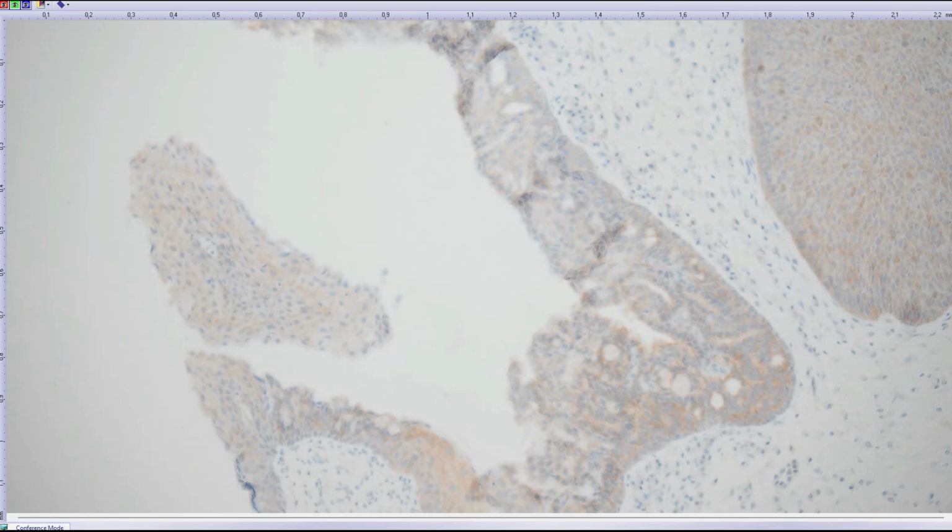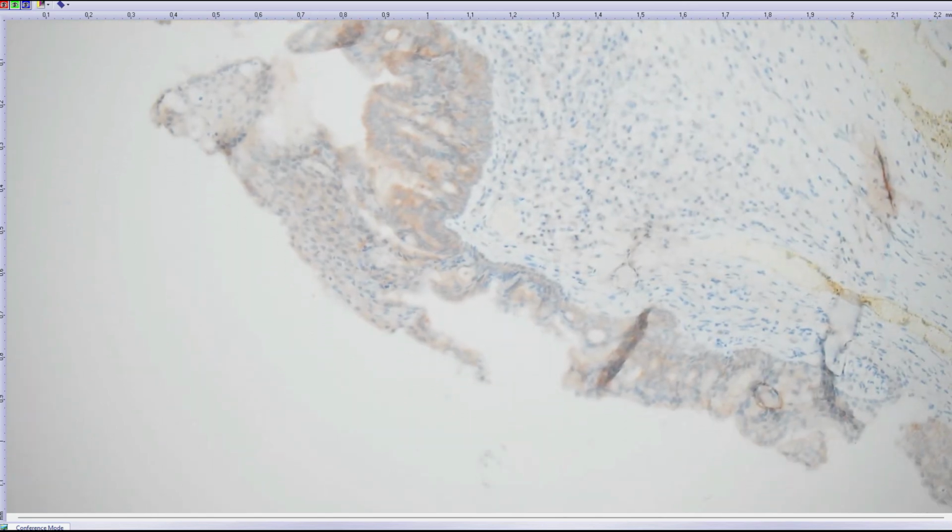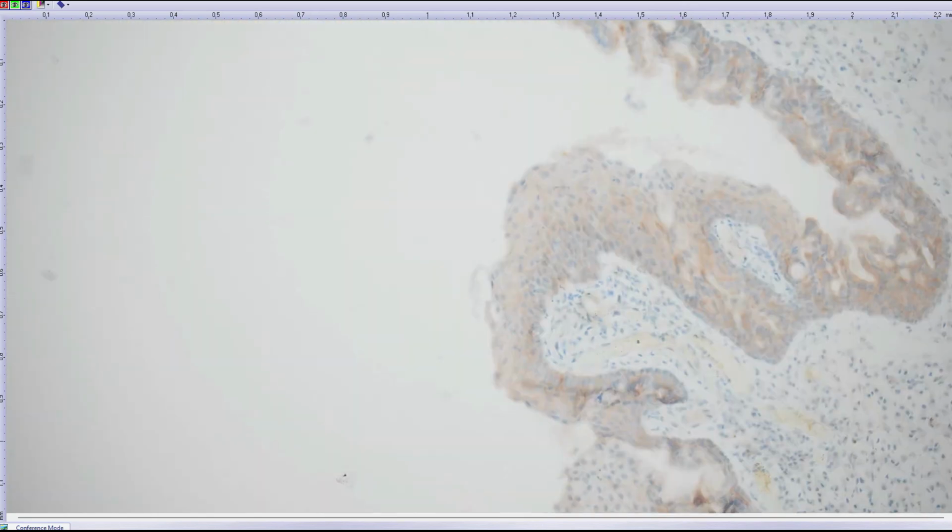So we think that this type of polyp will be one subentity of these interesting lesions. We think that the malignant potential will be very low. It will be practically the same as that of inverted papilloma.